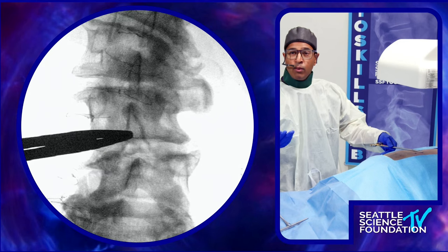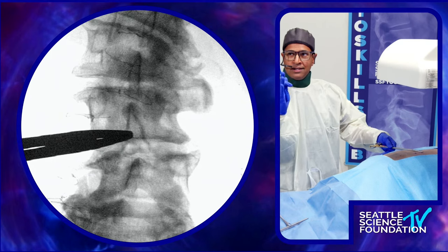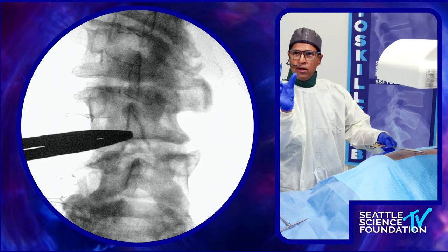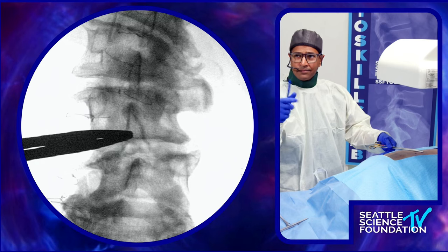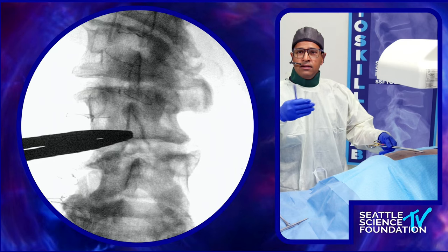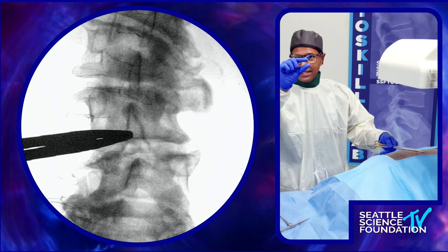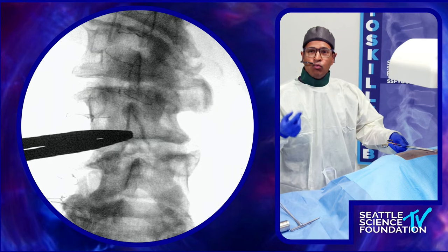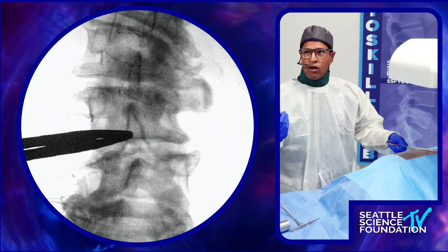The goal of this procedure is to simply get this titanium spacer in between those two spinous processes. We're using the pedicles of L3 and L4 to make sure they're equidistant from the spinous processes — think of them as the owl's face: the two eyes are the pedicles, the spinous process is the nose. If you're seeing a normal-looking owl, you're in good shape. Then we line up the superior end plate of L4. It's really important to line up everything well at the beginning of your case.